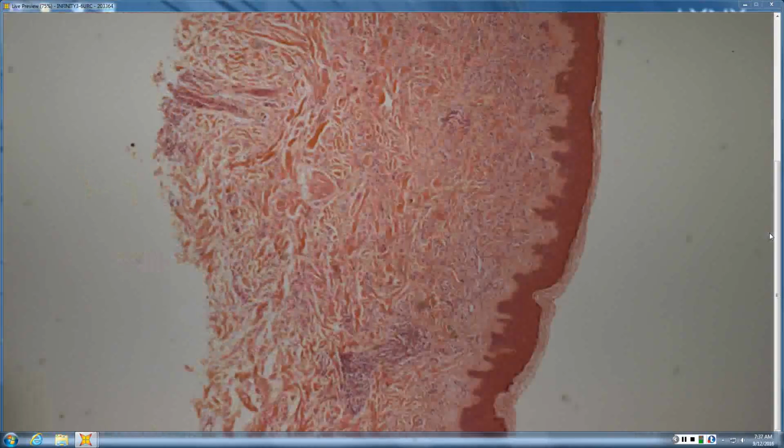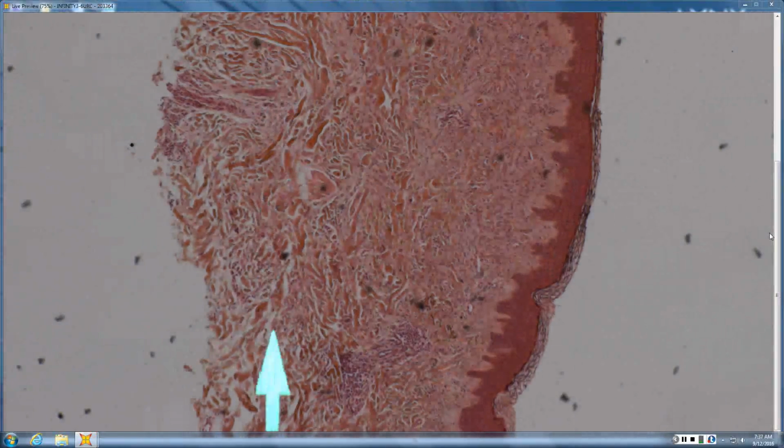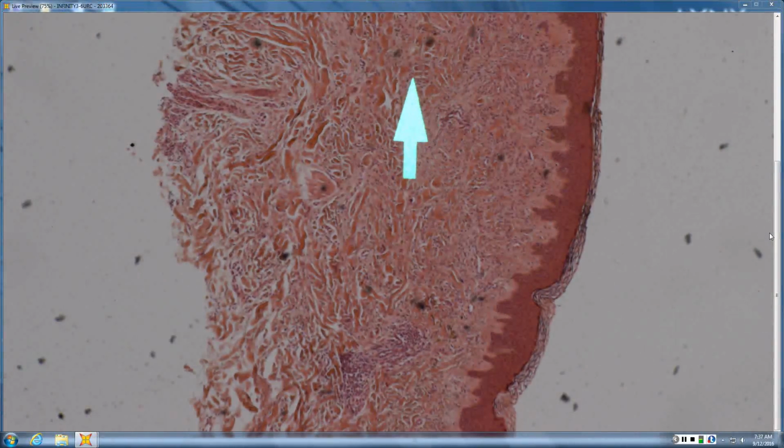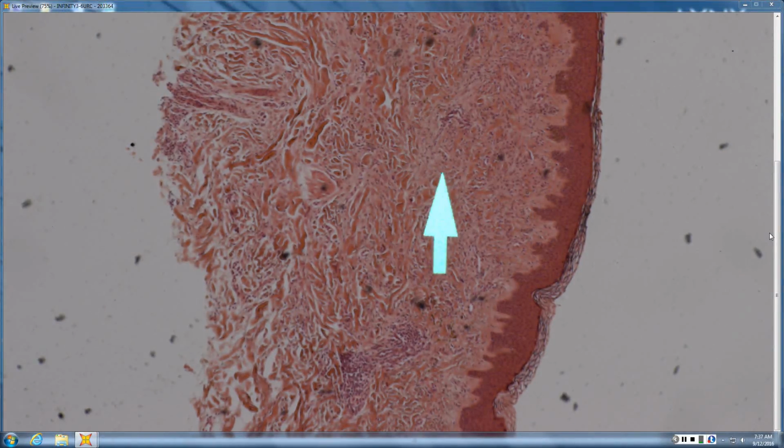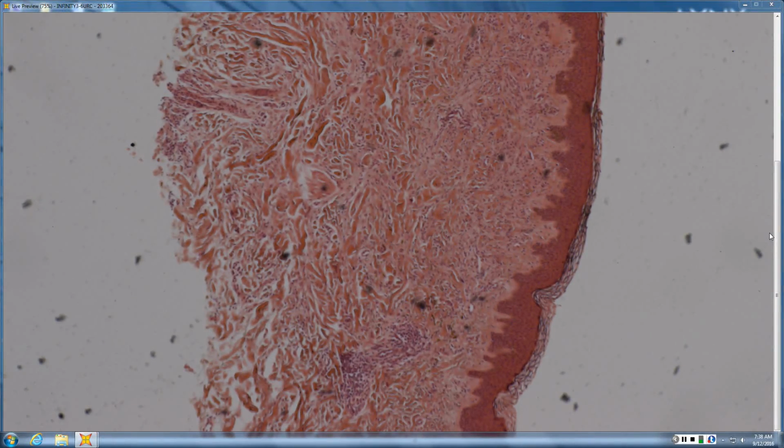So first off, at scan, the cells become smaller and disperse into single file at the base. That's all good, right? There's nothing that seems to be pushing collagen bundles away. It's not a bossy lesion that's pushing things out of the way. So that's all nice and seems like a nevus. And then you got a mixed population of large spindle and epithelioid cells as well as small cells. So probably a combined banal Spitz. Okay.